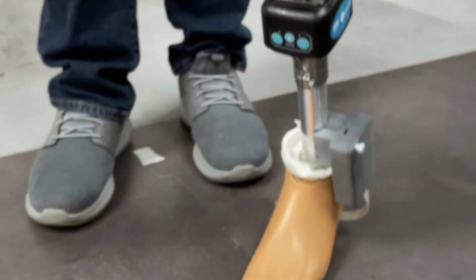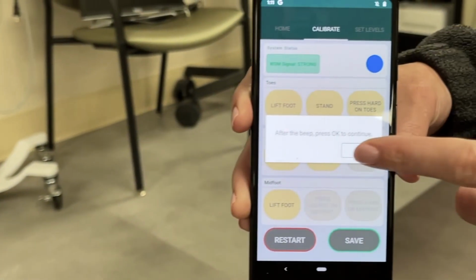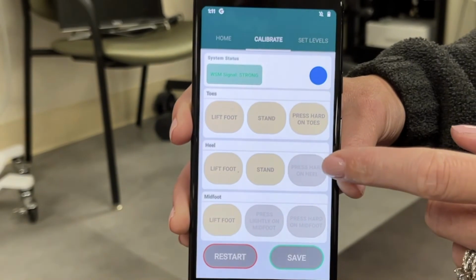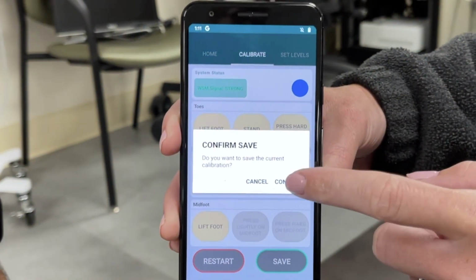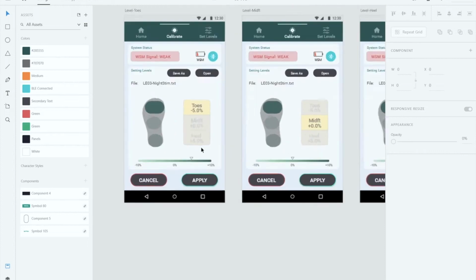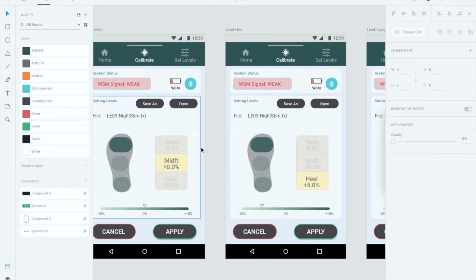And at the same time, we should be able to collect data on how the system is being utilized without repeatedly asking the user to write down how and when they use the system. My proposal to develop a smartphone application for our neurally integrated prosthesis was funded through the Garbrick Incentive Program.